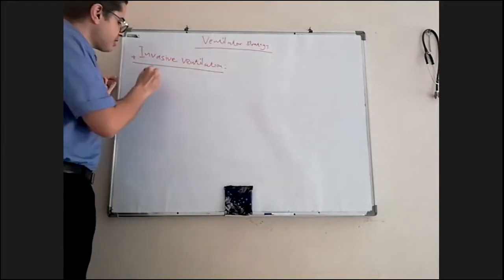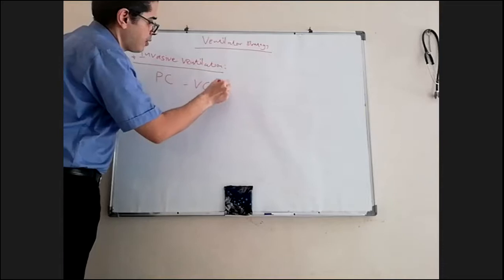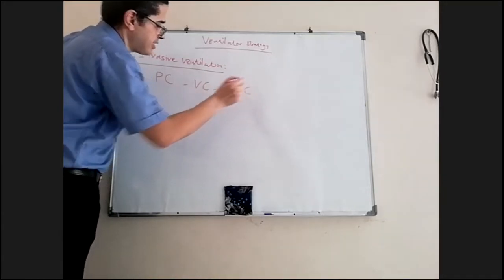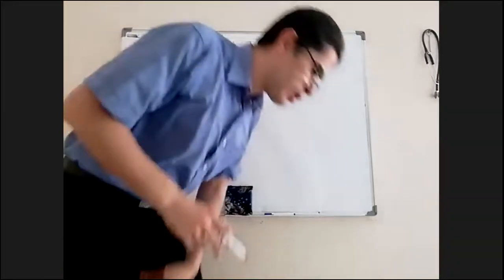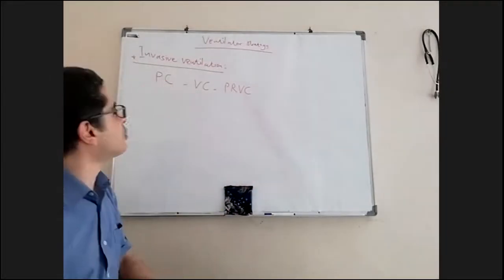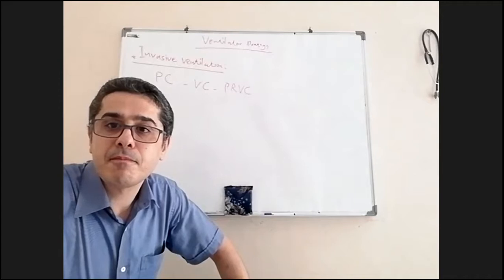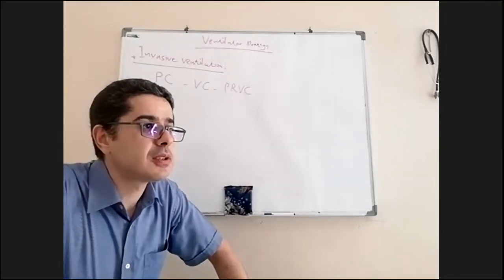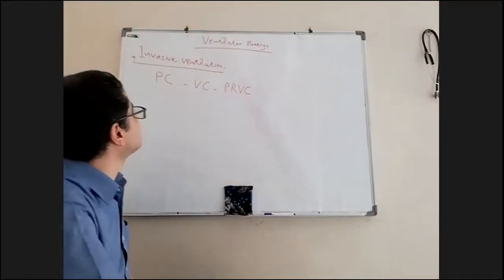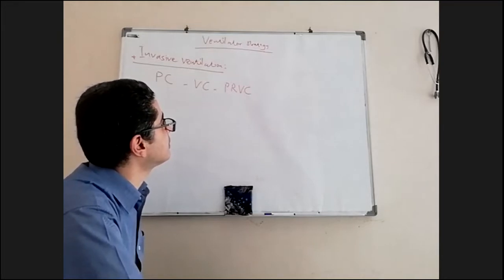So first, should we take pressure control or volume control or PRVC? Yeah, they ask you which one you will choose. Okay, Dr. Fitri, which one you like to use, VC or PC or PRVC? I prefer volume control. Why you prefer volume control? Because the volume is already pre-calculated, rather than the pressure, which can be determined by obstruction or kinking of the tubes.